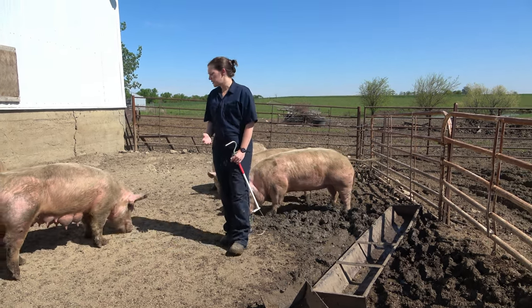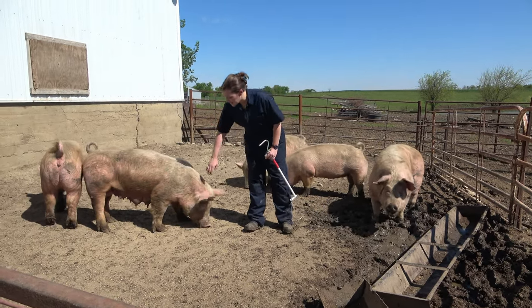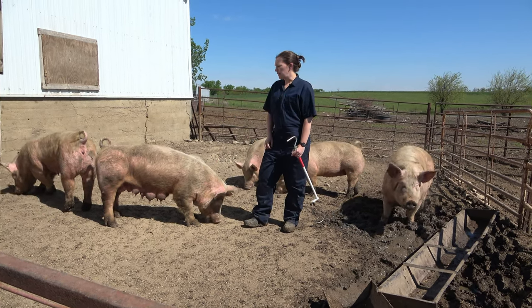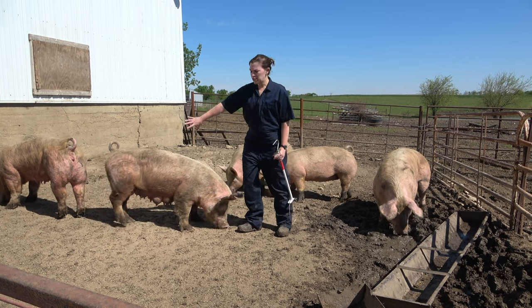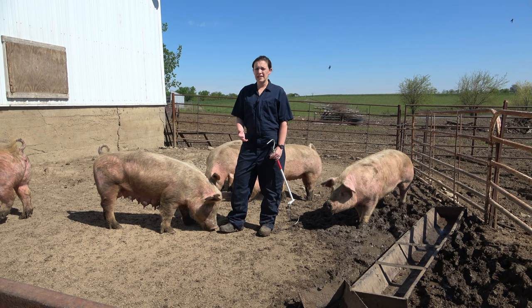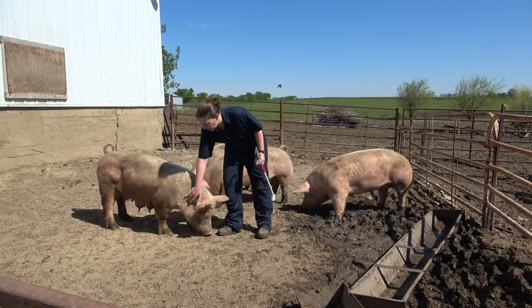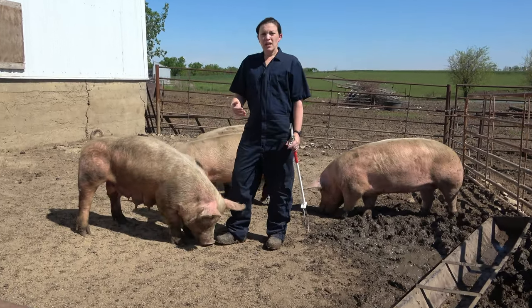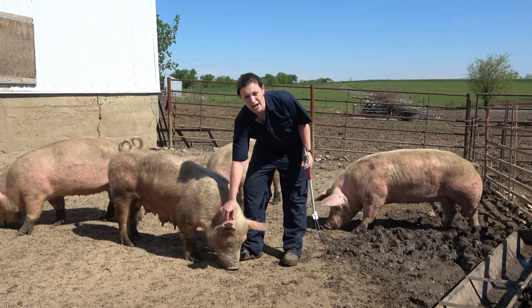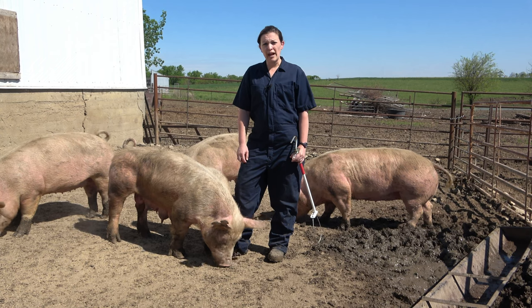Really quick, I just wanted to say that for IM injections on all pigs, it's a good idea to give them right here in the neck, because when we work with things like market hogs that are meant for butcher, we don't want to damage any of the meat. So even if you are working with pet pigs, they won't be butchered in the end. It's still a good practice to not give an intramuscular injection on a pig anywhere but right in this triangle in their neck. Similarly, with subcutaneous injections, they have nice loose skin right here behind their ears. So if you do need to give a subcutaneous injection, you can give it right there behind their ear.